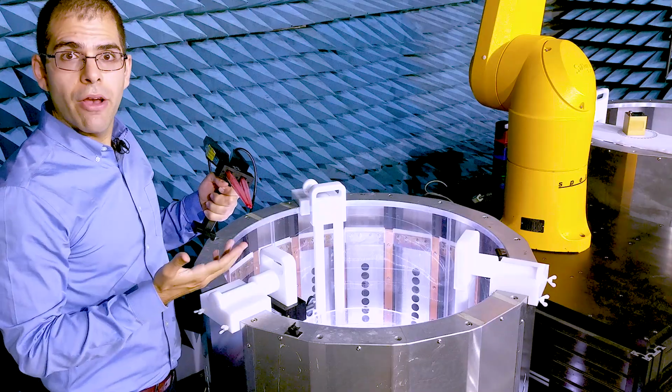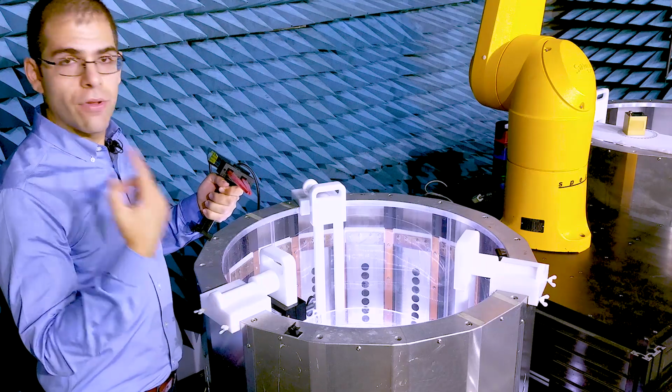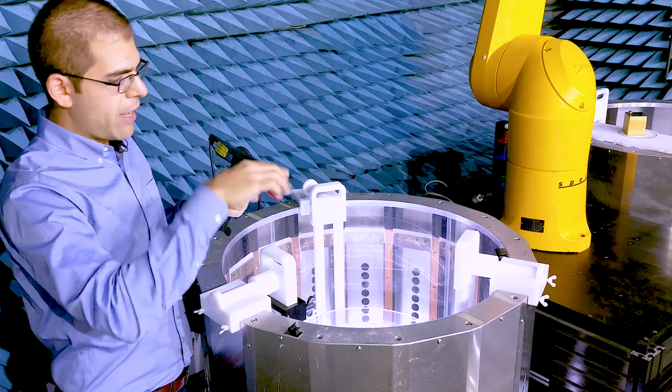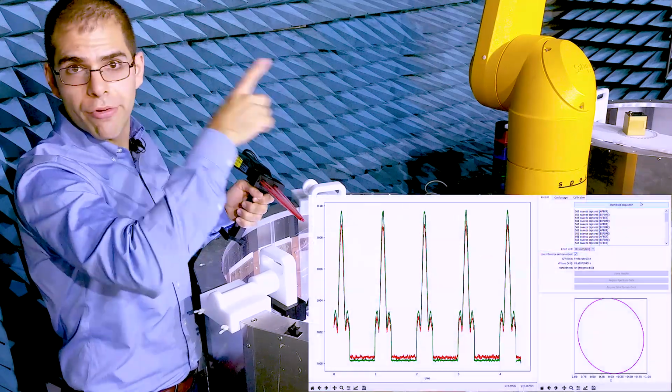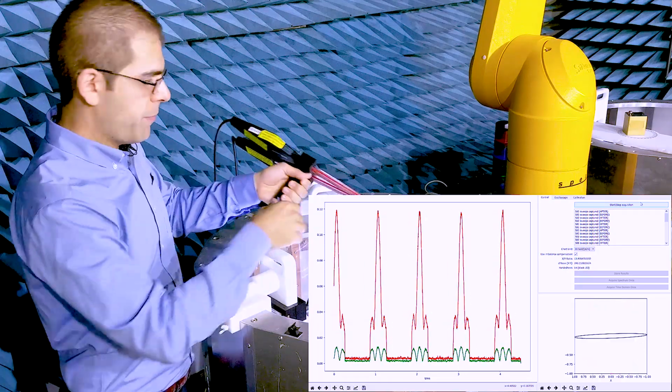I made a separate video that showed in more detail how this works. You won't see much of it here because it's fully automated in the DAISY workflow. But you can watch that video and see how these two fields together capture the polarization ellipse of the MITS for each incident polarization that we use.